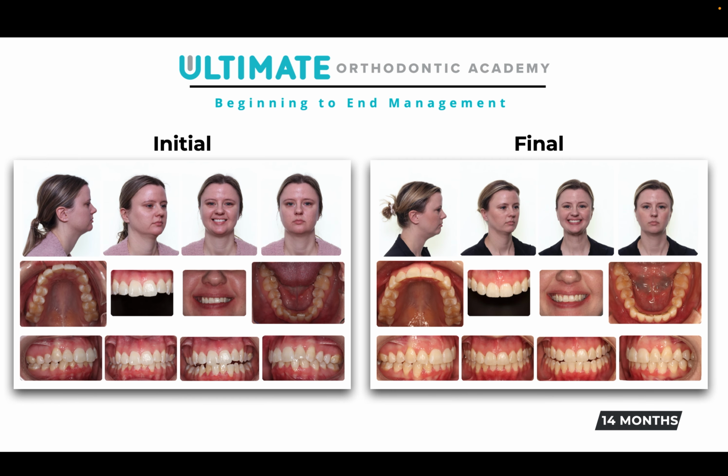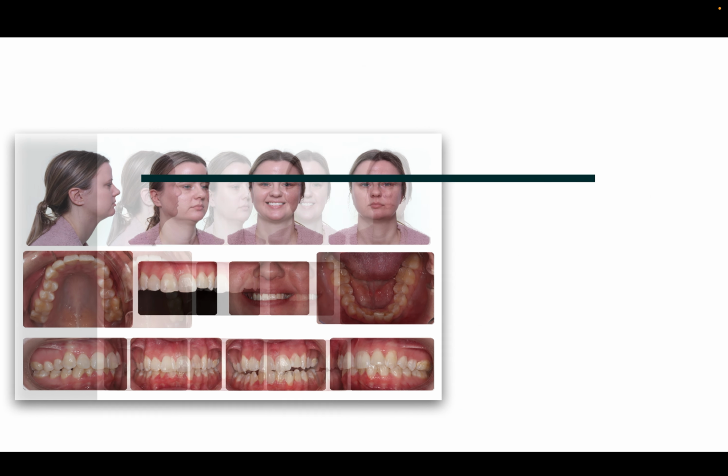So before and after, you can see that we got some really beautiful arch development. Teeth look great, occlusion's nice. So we definitely hit the mark on this case, and I'll show you how clean it was. Treatment time was about 14 months.